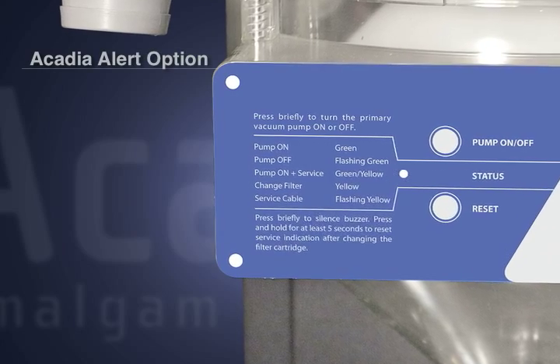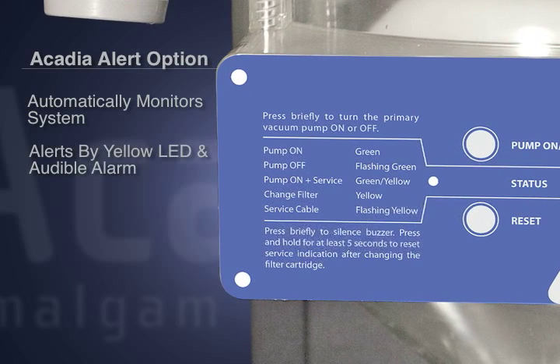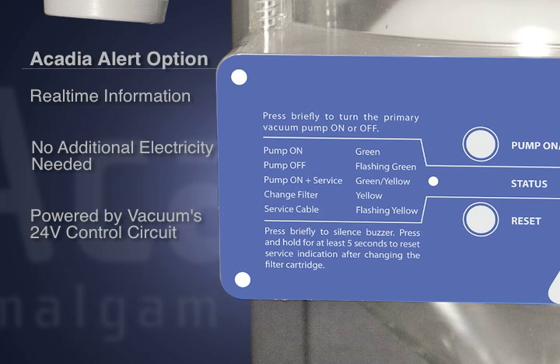Acadia Alert automatically monitors your amalgam separator. A yellow LED light and audible alarm activates when the filter is at 90% capacity. It can be installed in any operatory to give you real-time information. There is no additional electricity needed, and it is powered by your vacuum's 24-volt control circuit.